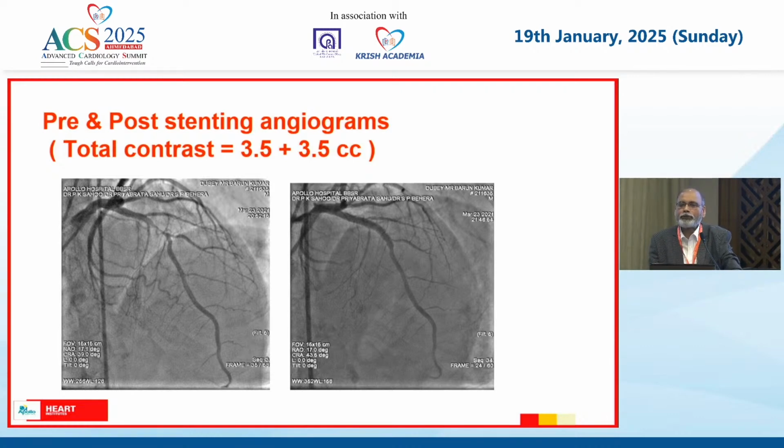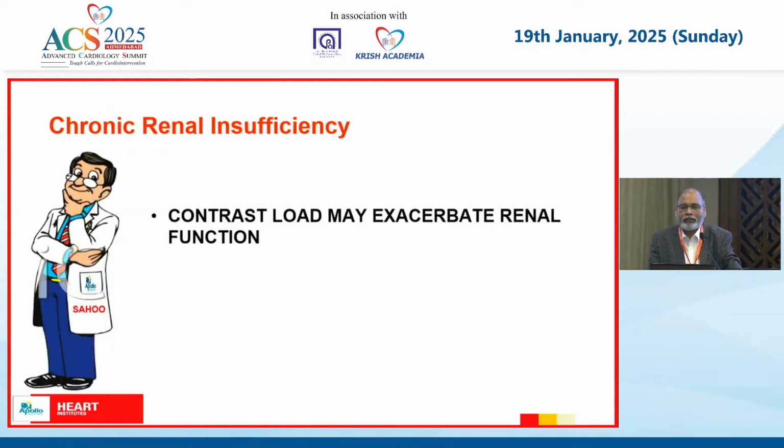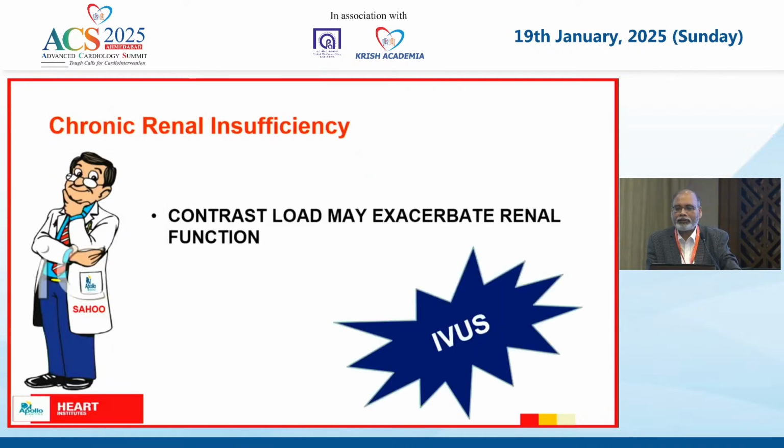So pre and post stenting angiograms can be easily done, and people are doing a lot of work on this, on no contrast procedures. But I believe that is a misnomer. There should be minimal contrast. Contrast load may exacerbate renal function, so always use IVUS in CKD.